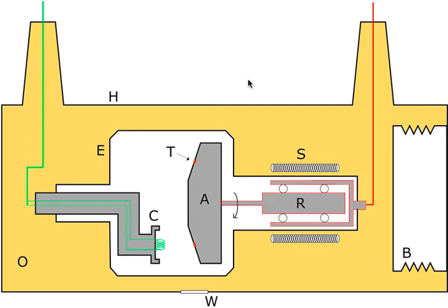Hi everyone, today I'm going to talk about the X-ray tube and the different components of the X-ray tube.